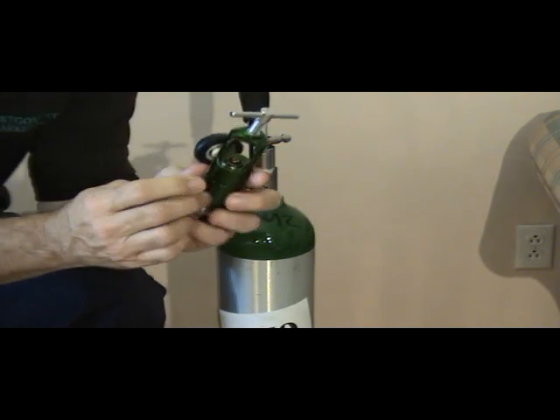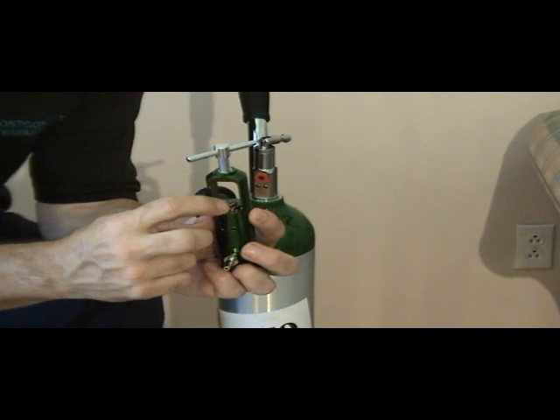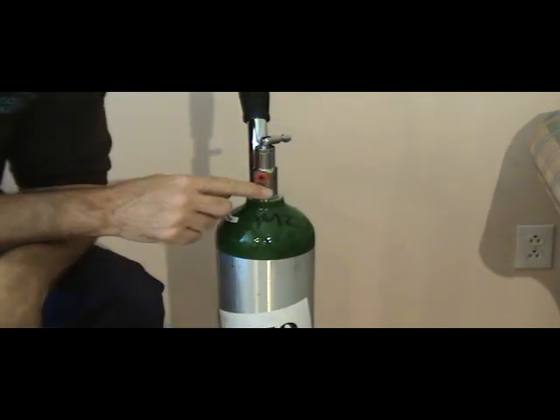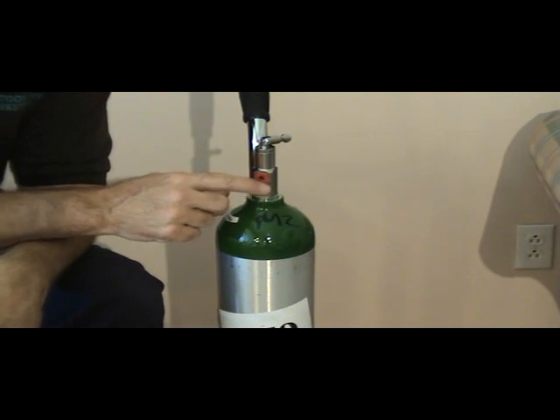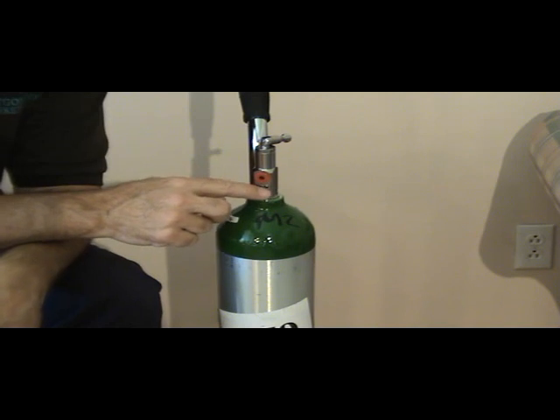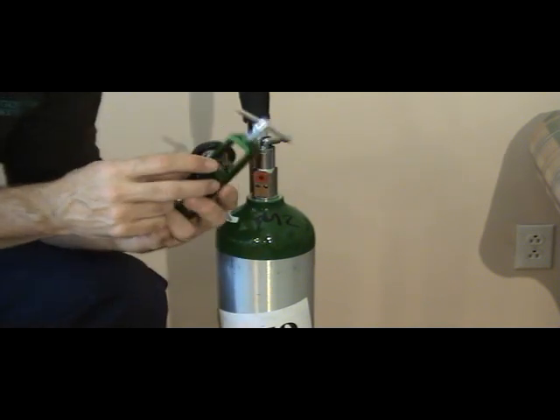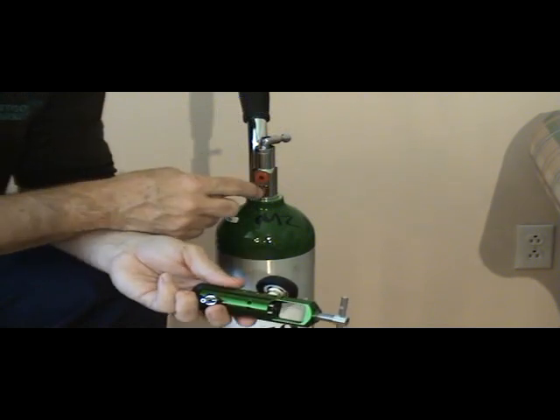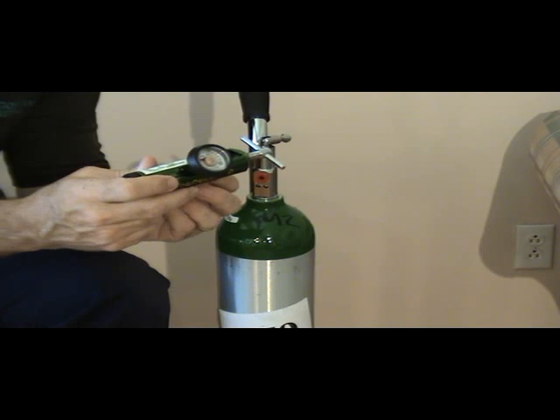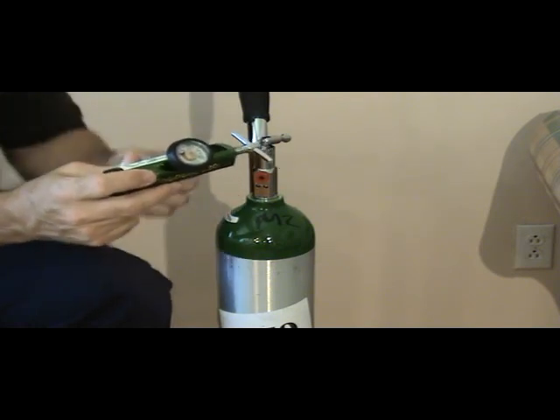Inside the regulator here, you can see these 2 pins on the bottom, and then on top of that there is a hole. On the bottle, right below the red washer, are 2 holes. So what you need to do is align the pins right here with the 2 holes, which means the pins are going to be on the bottom of the regulator. Okay, so we position the pins at the bottom.